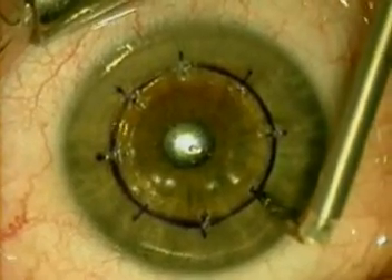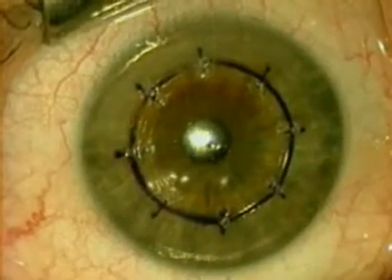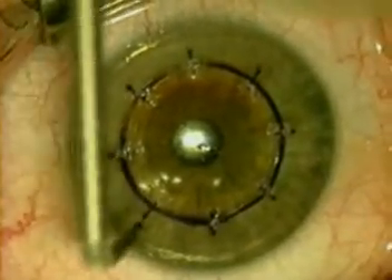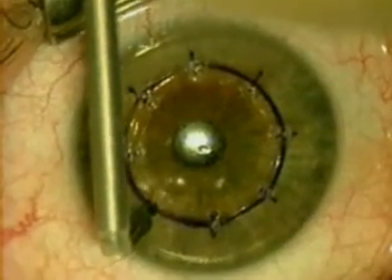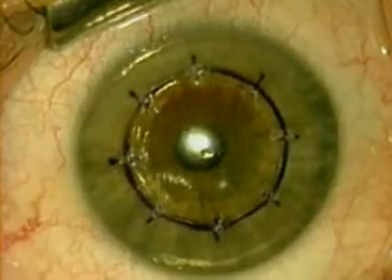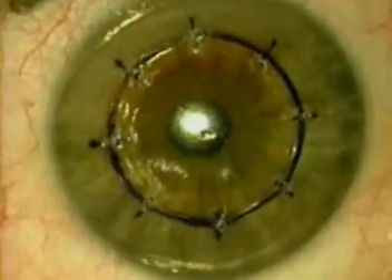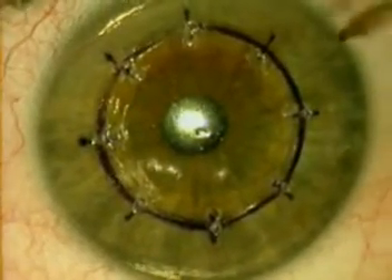Care is taken to make sure that the tip is inserted in a perpendicular orientation to the cornea. We look at the tip after each application to make sure that there are no epithelial plugs that have developed. As you can see, the procedure can be performed comfortably in less than three minutes.